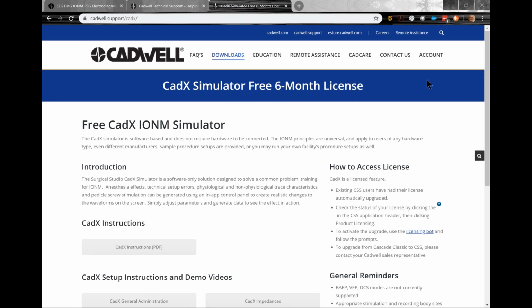Jonathan, have any questions come up that you're aware of? There have been a few. Some I've already answered, but I have one that someone's asked. Can you take a screenshot of the event log? Sure. There's not a reason in the world you couldn't maximize the window and then do a screenshot of it. Depending on how many events you have in there, they may not all fit on the screen at one time, but certainly you could take a screenshot of it.